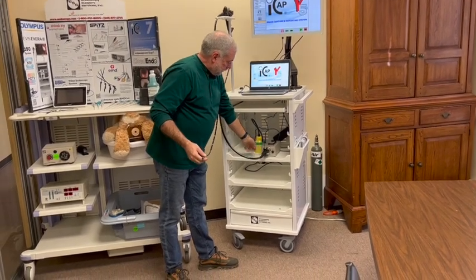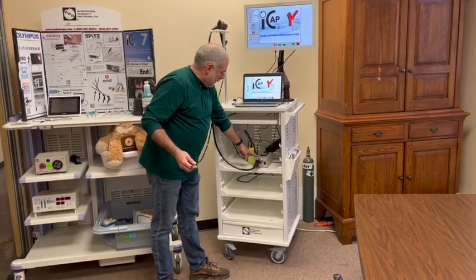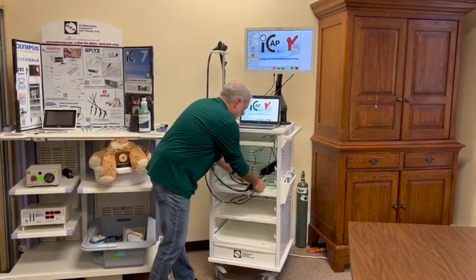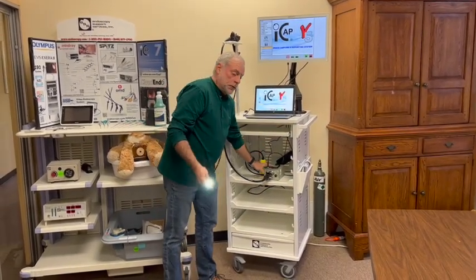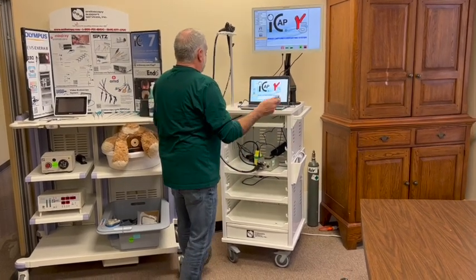Down here we have a high-intensity LED light source with an air pump for air and water. The water bottle plugs in the side like so. Simply turn it on and you get light and air. I'm going to turn the air off for this demonstration.